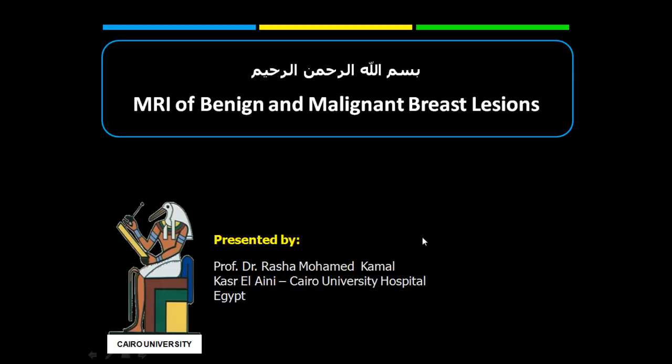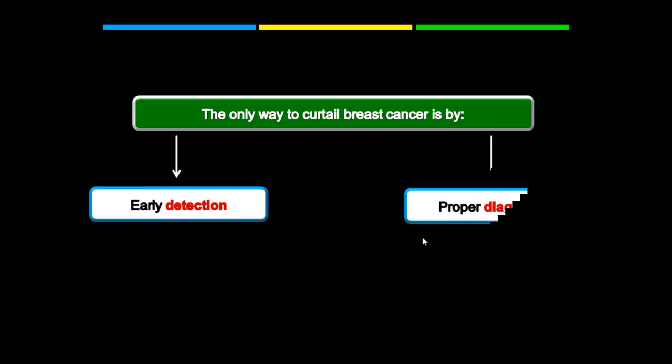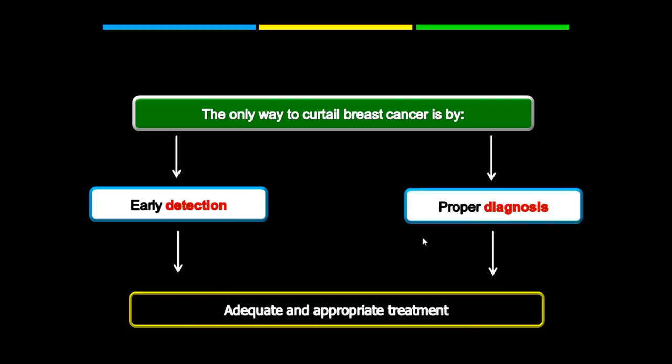Bismillah ar-Rahman ar-Rahim, MRI of benign and malignant breast lesions. Over the past few years, there has been significant development in the investigation and management of breast cancer, because it was found that the only way to curtail breast cancer is by coupling early detection together with proper diagnosis in order to be able to give the patients the most adequate and appropriate treatment options.